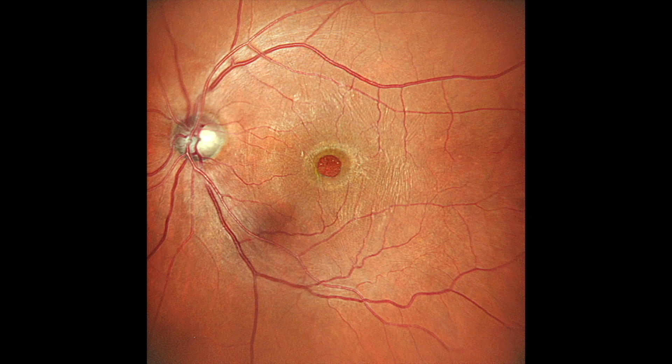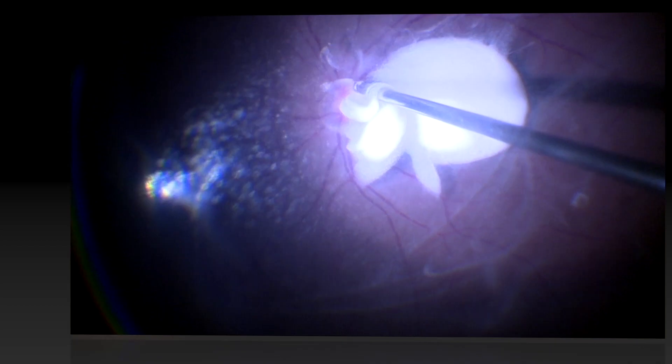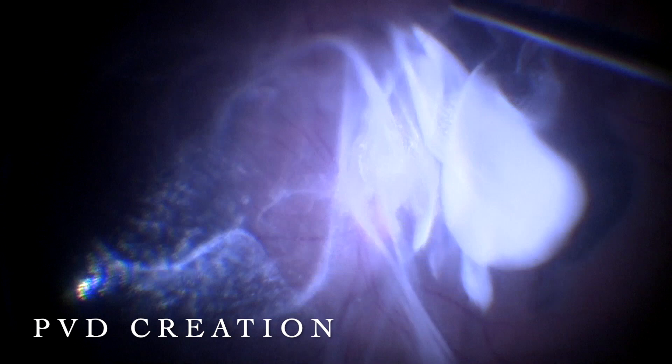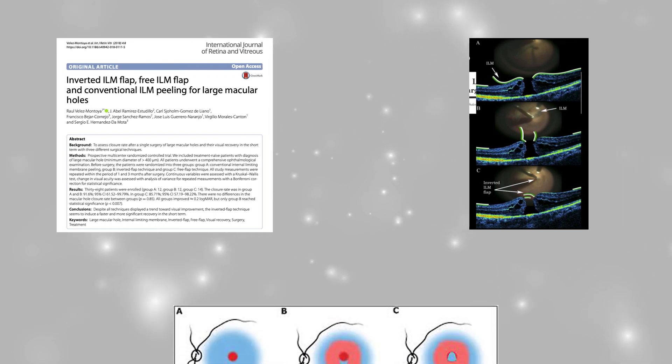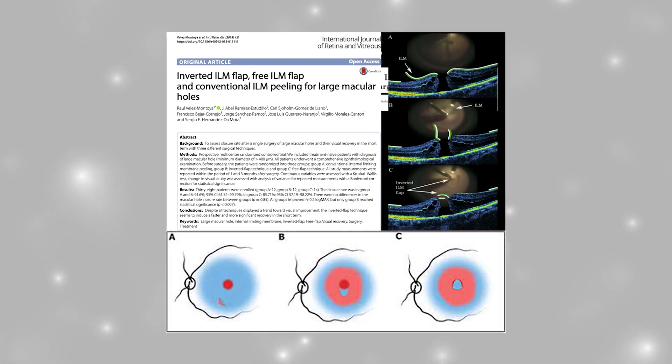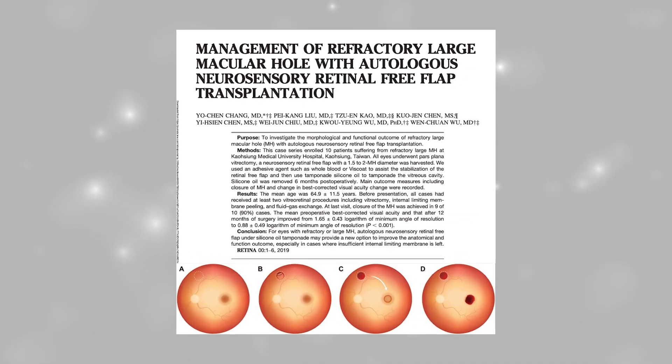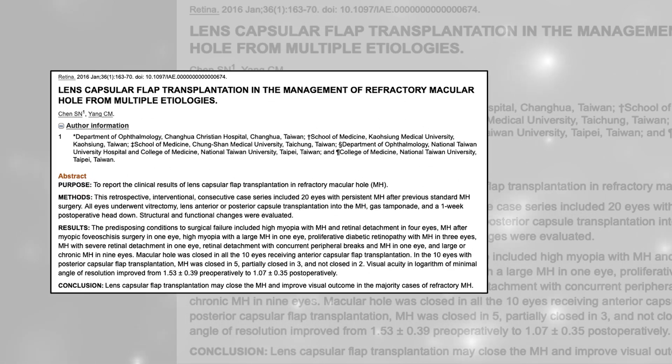Surgery for macular hole is one of the most commonly performed vitreoretinal procedures. The first step is to achieve a good PVD creation. This is followed by an ILM peel after staining with brilliant blue dye. Following these steps, several modalities such as inverted flap, free flap, and autologous lens capsular flaps have been used to facilitate closure of the hole.